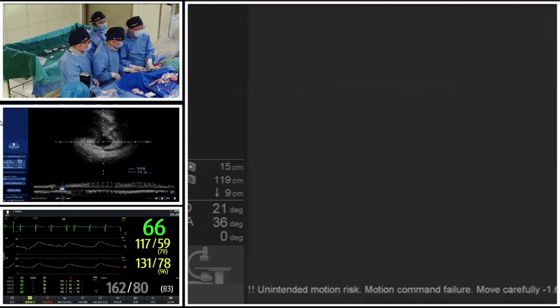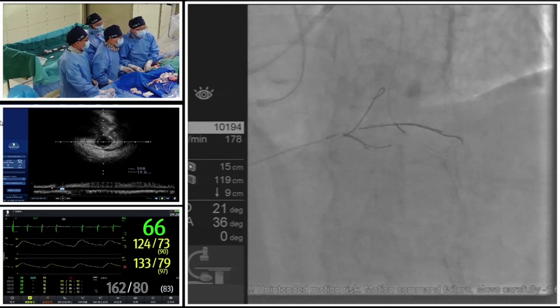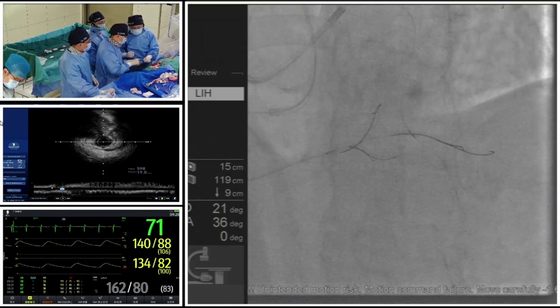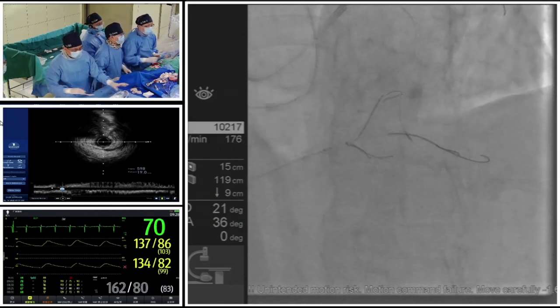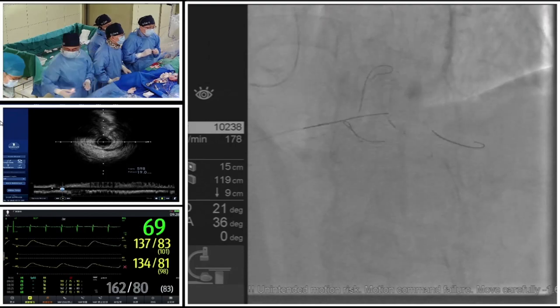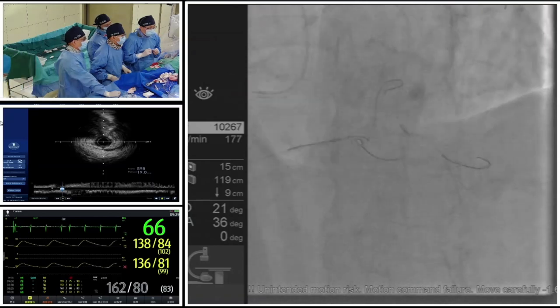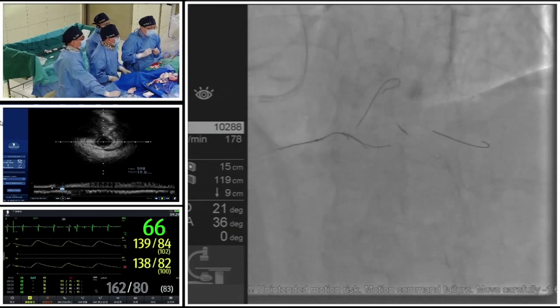Okay, we are performing the second time using the dual lumen catheter to try to go into the PDA side branch. During the course of withdrawal, we could advance the wire to the PDA. Okay. So, Professor Lee, what wire are you going to use for this puncture, this antegrade? I think commonly a workhorse wire. Okay. Soft wire. Okay. I just like to use a polymer jacket or other very strong wire, but here, yeah, a little bit difficult. Mm-hmm. Yes.